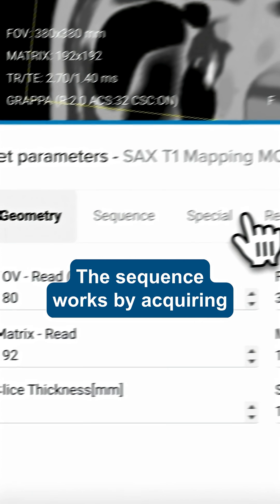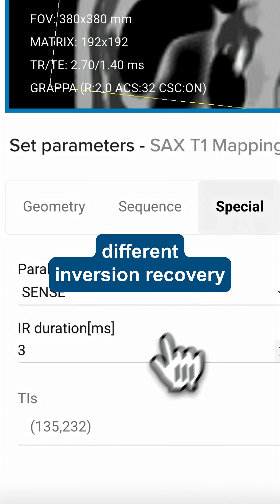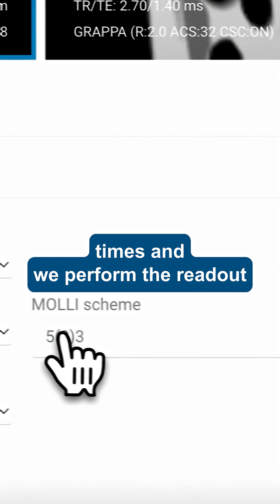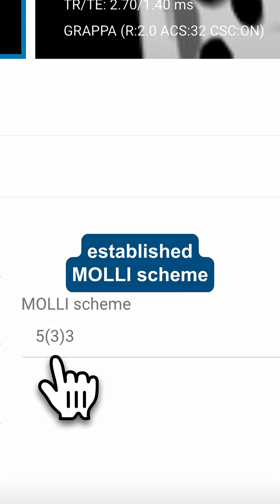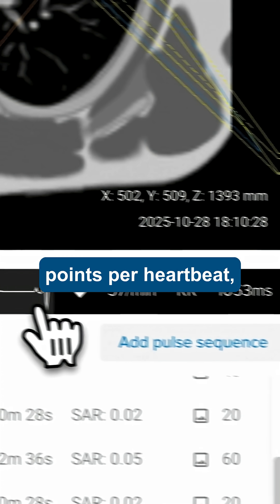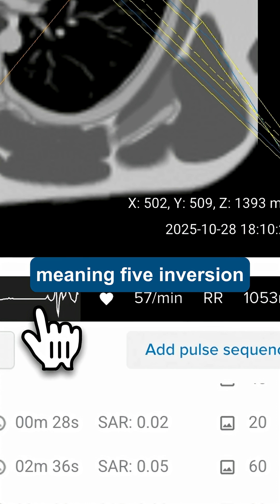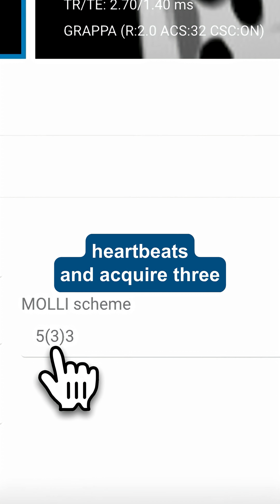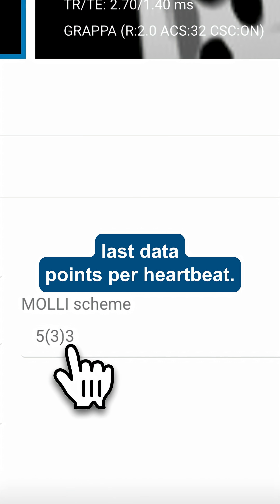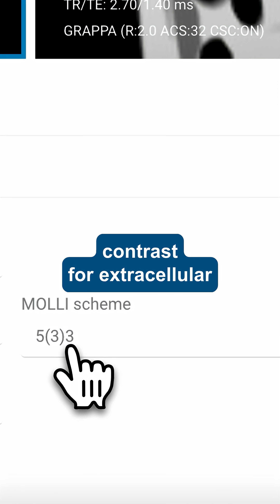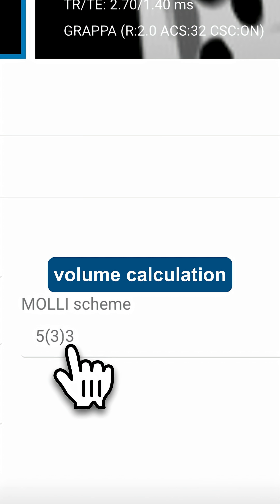The sequence works by acquiring different data points through different inversion recovery times, and we perform the readout acquisition using the established MOLLI scheme. In this case, we'll acquire five data points per heartbeat, meaning five inversion recovery times. Then we provide a pause of three heartbeats and acquire three last data points per heartbeat. We typically acquire this sequence both with and without contrast for extracellular volume calculation.